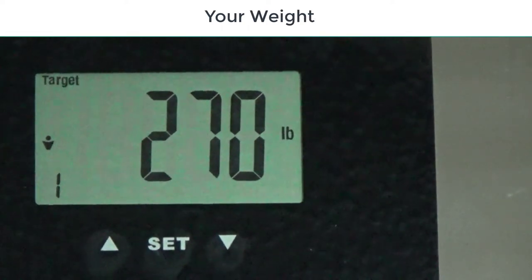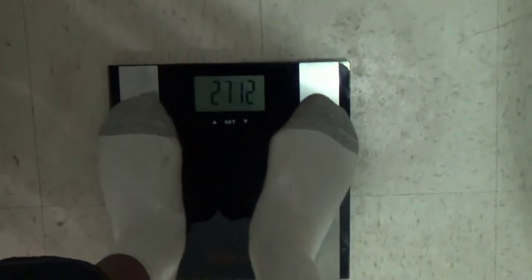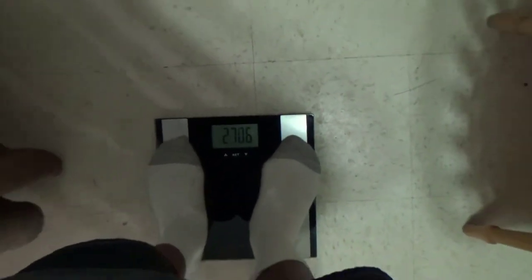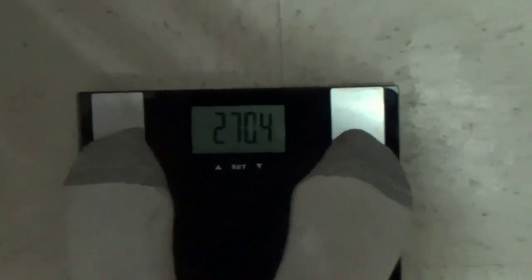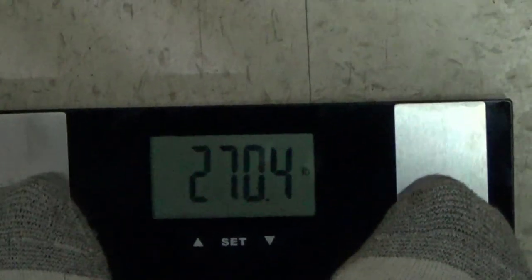And it recognizes once you step on it. You don't have to do this anymore. Once you step on it, it recognizes your weight and it'll know that it's number one.